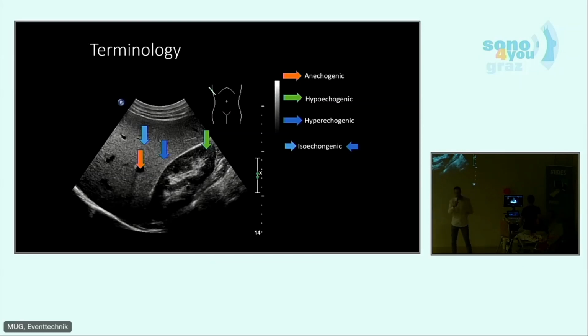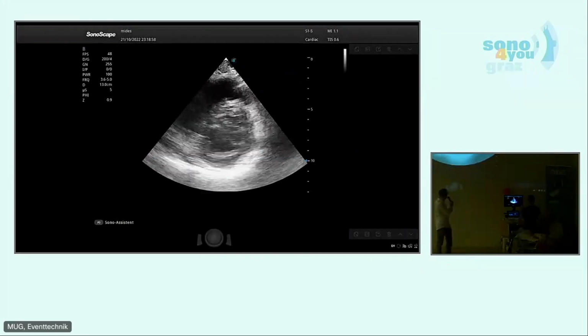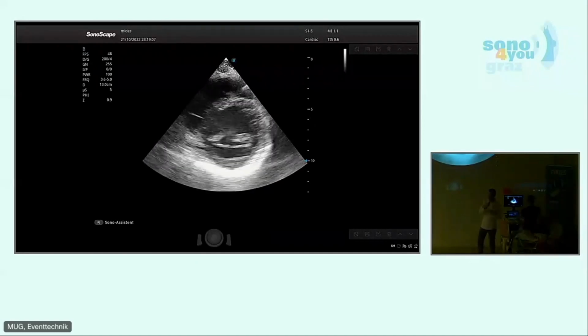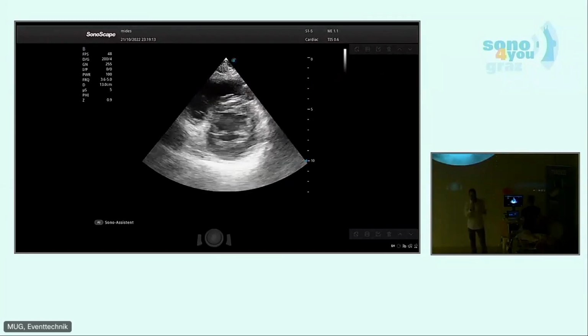Great. So the 2-dimensional normal section we also call the B image, the B mode image. We already got the basics now, and I think for some of you it was a repetition. Now we want to present 2 other imaging modes that are important and that you will also see within the next 2 days. As our demonstrators show, if we switch now to the ultrasound image, you can see a heart pumping there. And this little donut you see in the middle is actually the chamber of the left heart.